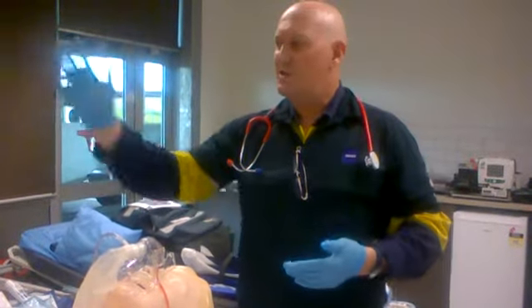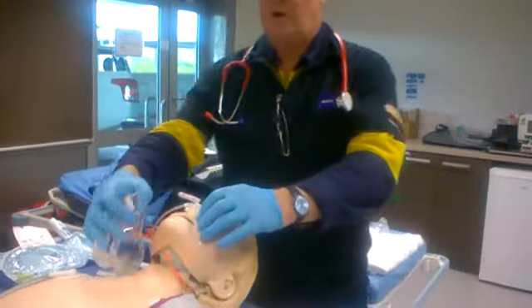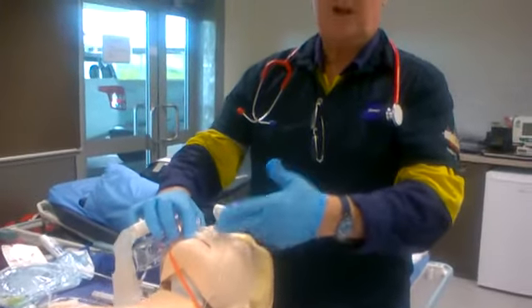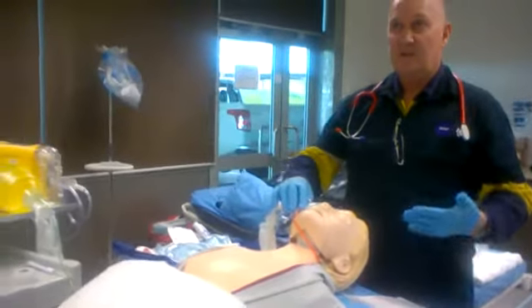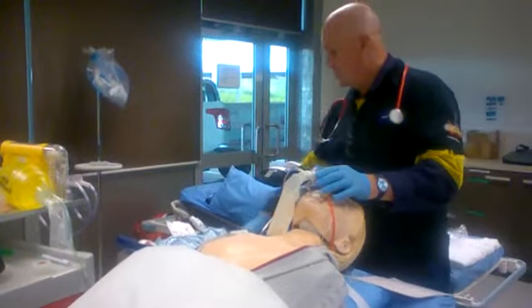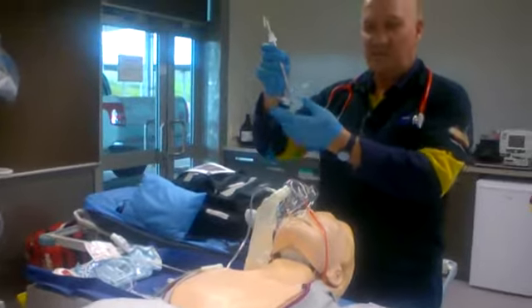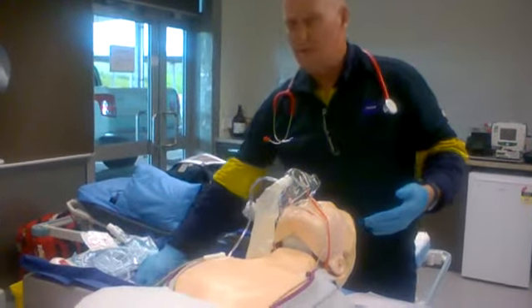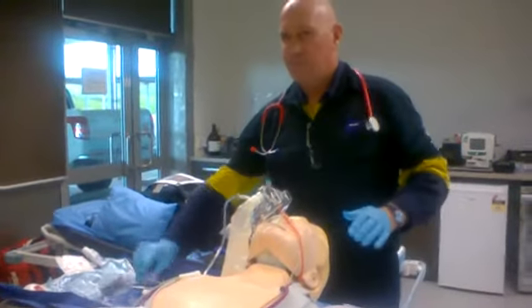So we look at suction units, close at hand. We have oxygen. We have nasal oxygen on, also with capnography hooked up to our Tempus Pro that is monitoring at that time. So we can get oxygen to the patient. So we have our ET tube, bent at 30 degrees like a hockey stick, that we check the cuff inflation. We also have an LMA that's checked. We check the cuff inflation.